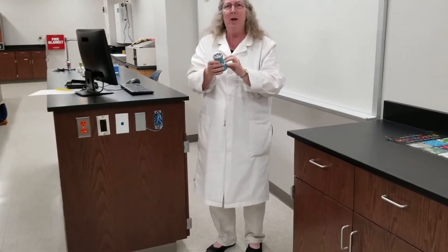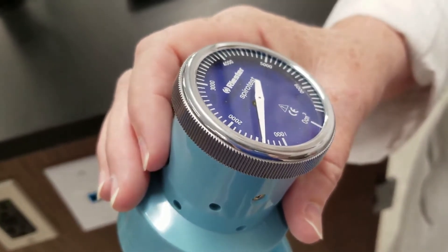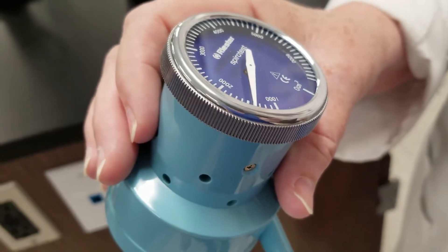You'll notice I went to a 90 degree angle to try to force out as much as possible. So the expiratory reserve volume on this one looks to be about 1,300.